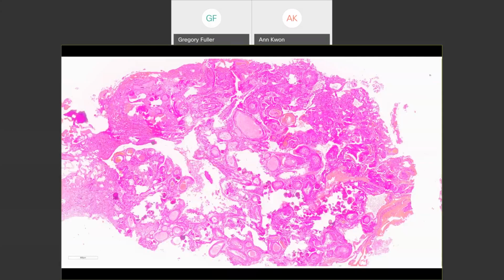And you know what? Choroid plexus epithelium is very delicate. And you know, you put the cautery to it, it's gone. It's vaporized. All right. And so you're going to have to hunt for the preserved areas, and they're going to be distorted by the cautery artifact.